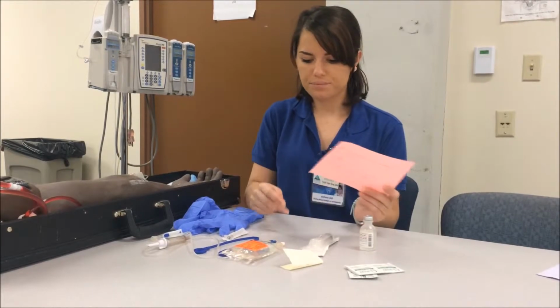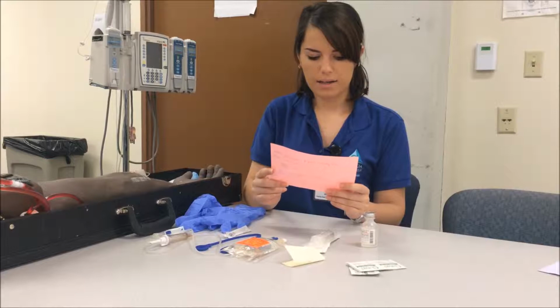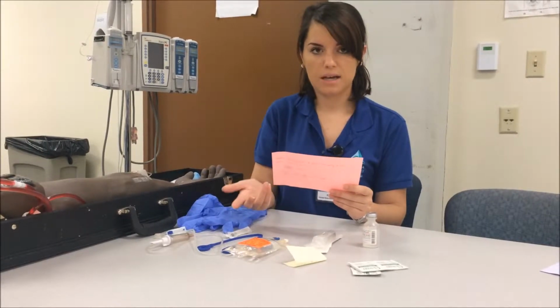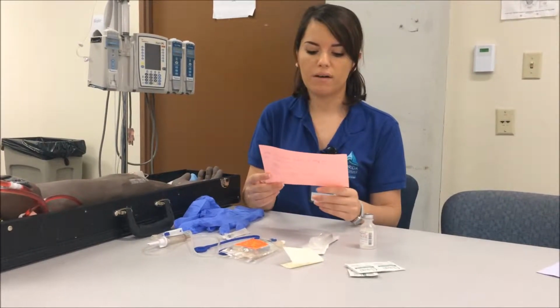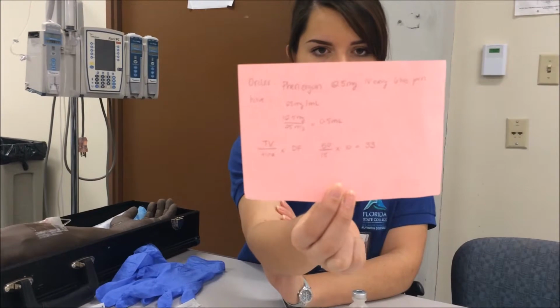50 milliliters, divided by 15 minutes, which is the time it's going to be infused, times 10, which is my drop factor, and that gives me 33 drops per minute. And here's my calculation. Okay.